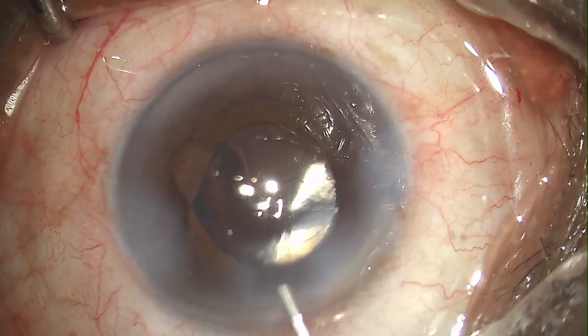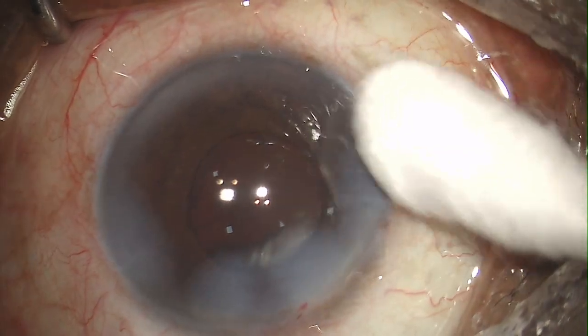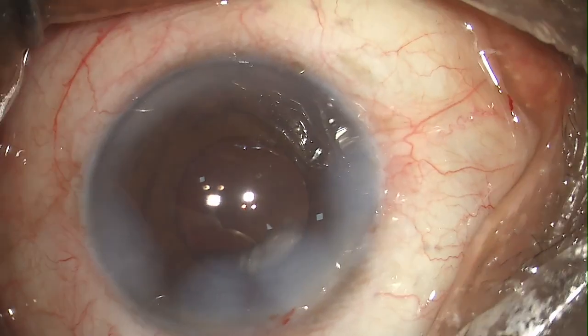Here I'm doing the closure of the wound. Checking the wound — the eye is formed quite nicely. Speculum is removed. Thank you.